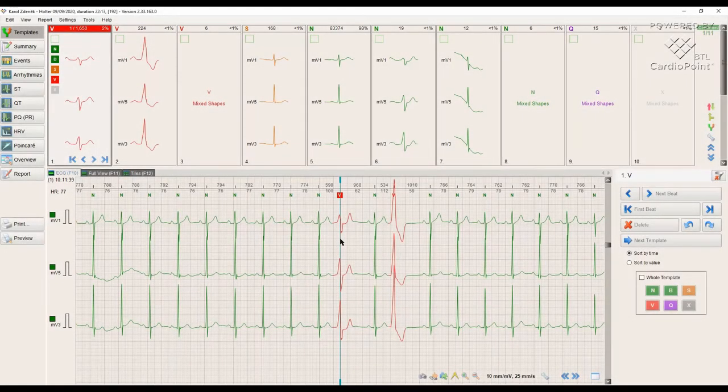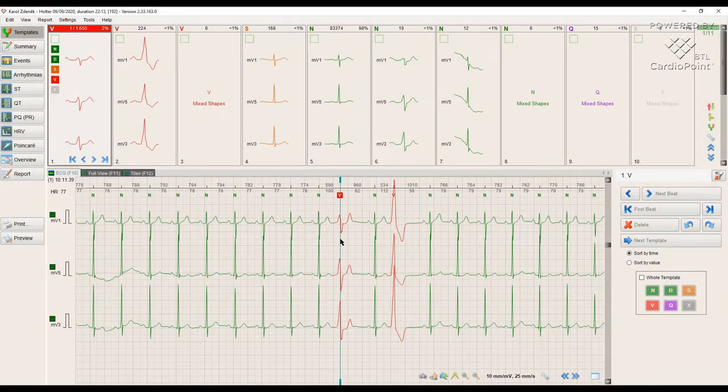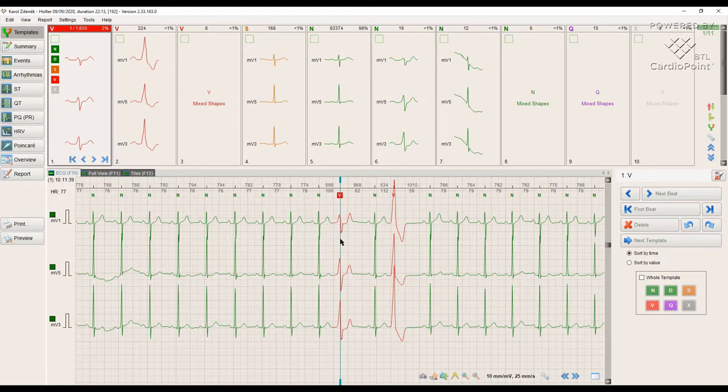In the templates module, we follow two main objectives: control of automatic diagnostics and partly remove the noise from the signal.